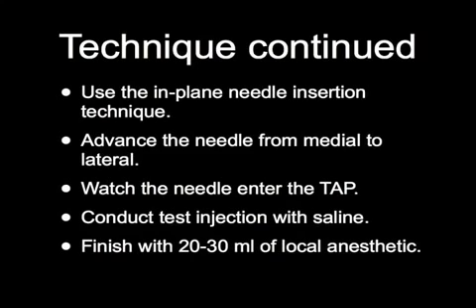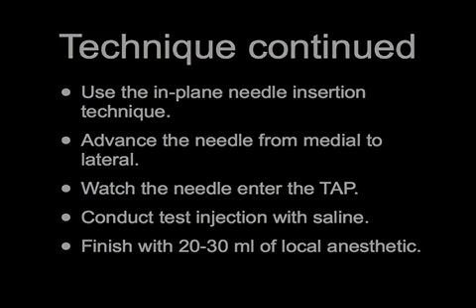Technique continued. Use the in-plane needle insertion technique. Advance the needle from medial to lateral. Watch the needle as it enters the TAP. Conduct a test injection with saline. Finish with 20 to 30 mL of local anesthetic once the saline injection confirms correct needle location.